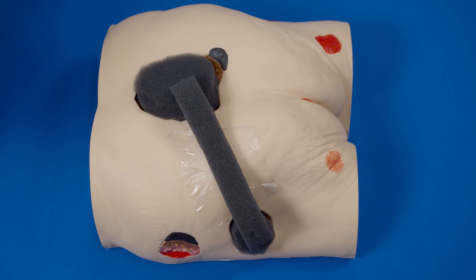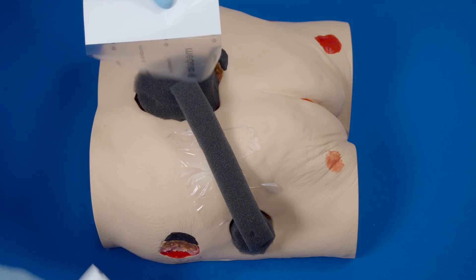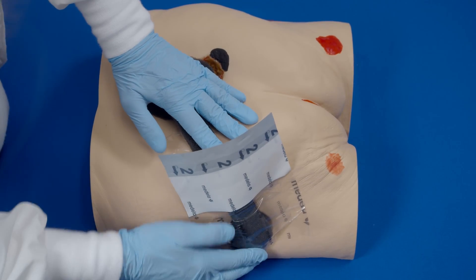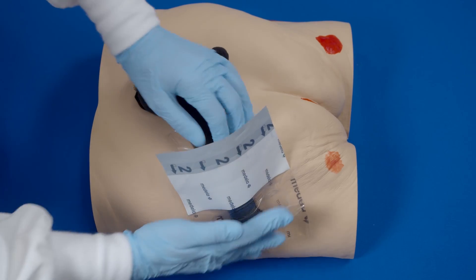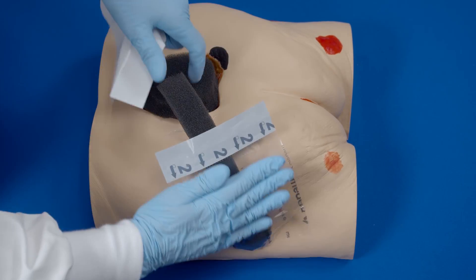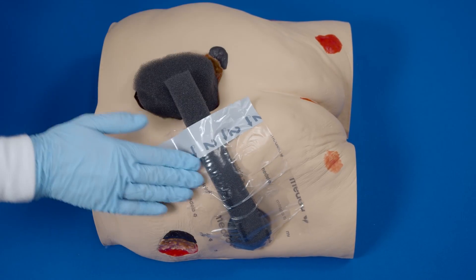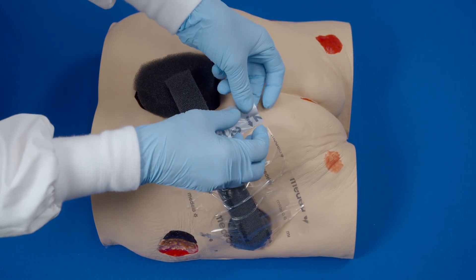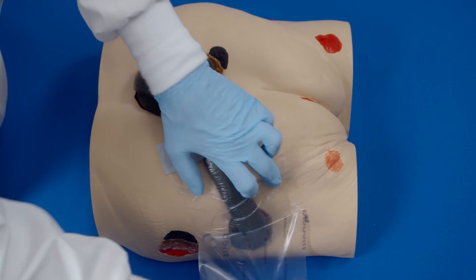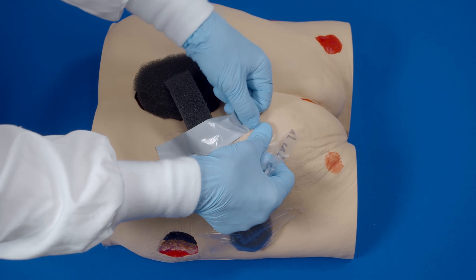Apply transparent film to cover all of the foam — both wounds and the bridge. Partially peel back one side of layer 1 and place adhesive side down, then remove the remaining side of layer 1. Now remove the backing, or layer 2. Remove the perforated silver-colored tab on the side.